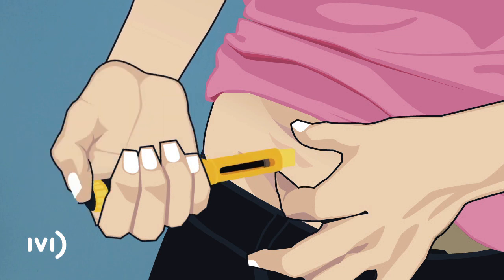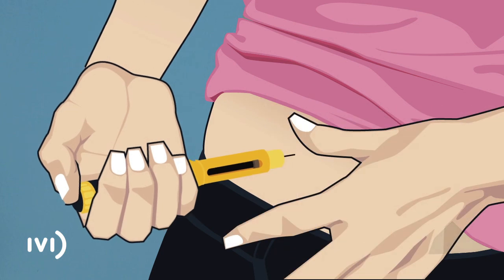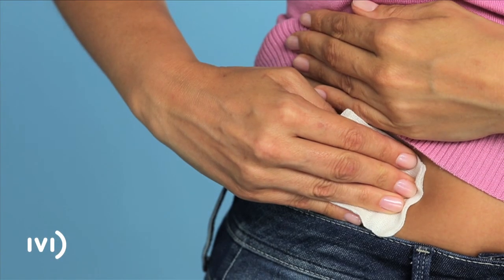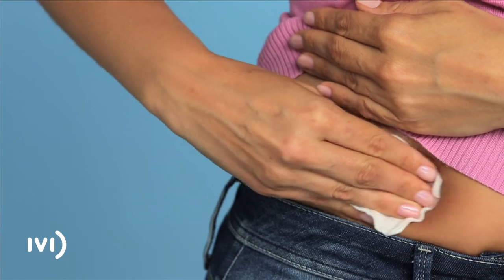Press the dosage dial gently until the display shows zero and you hear a click. Next, let go of your skin and pull the needle out gently. Press down on the area for a couple of seconds with the gauze while massaging it lightly so that the solution disperses under the skin.